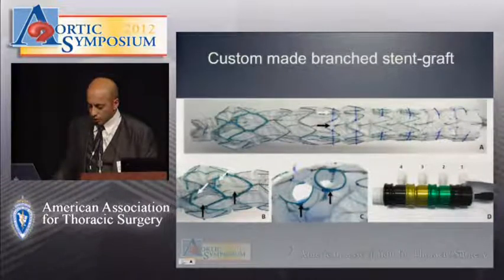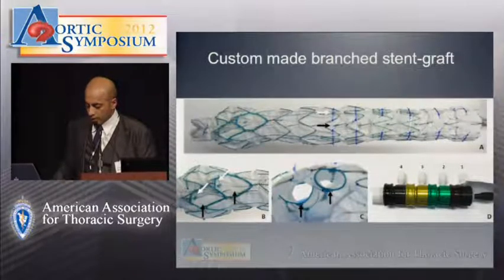Here we have external openings. This is not the actual branch. The branch is actually proximal to this external opening and is situated here for this branch and here for this branch. And this is what it looks like if you were actually in the graft lumen. There's a series of trigger wires that belong to the diameter reducing ties, belong to the bottom and the top of the graft as well.